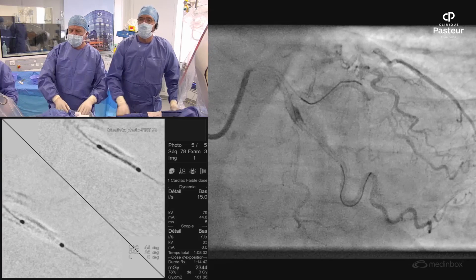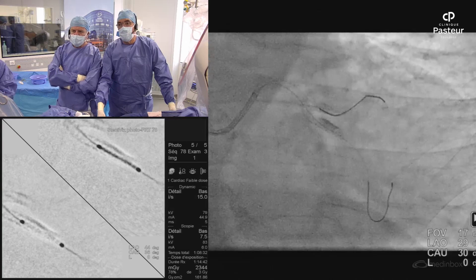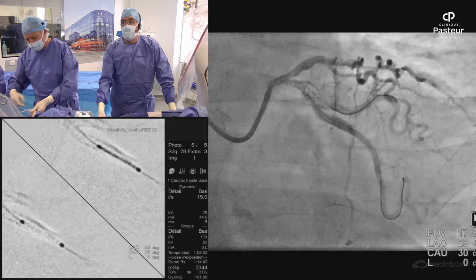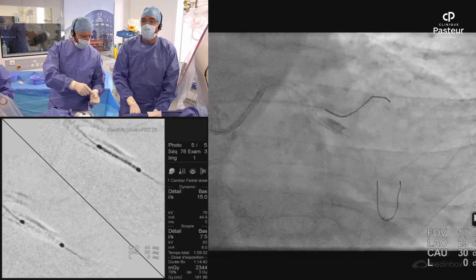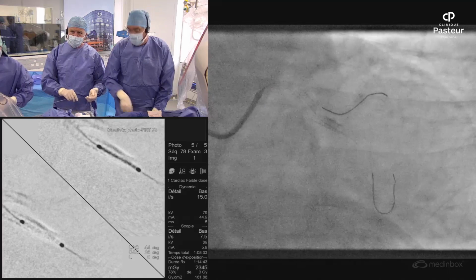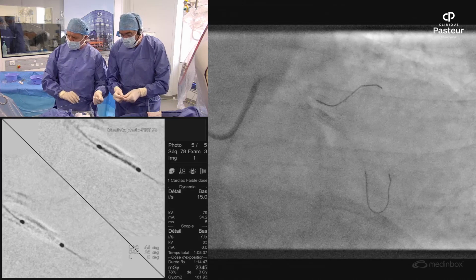Good. Yeah. We still have some dye, but it's okay because it's outside of the stent. Okay, the flow is good. Fixed, yeah. That dye must be within the layers of the dissection and is now trapped behind the stent, so that's not going to clear. With a 3.0. We can remove this one. So it's good. We can do the POT on this one, on the other one, whatever. It should be proximal to the bifurcation. So it could be on this wire. So this one will be a 3.0.